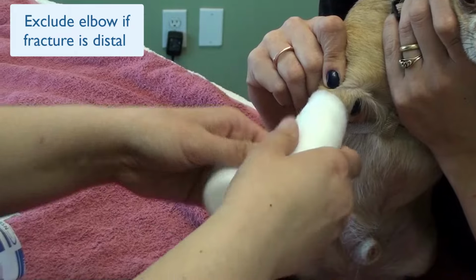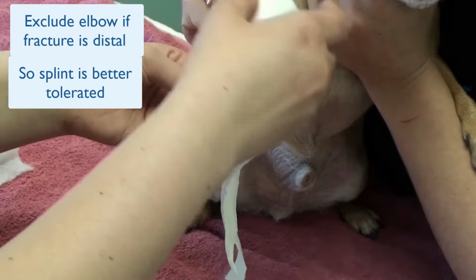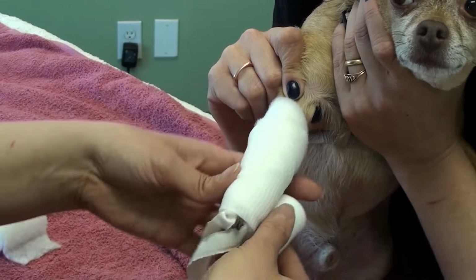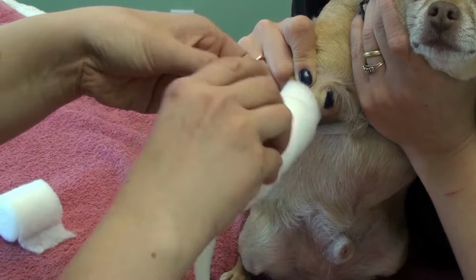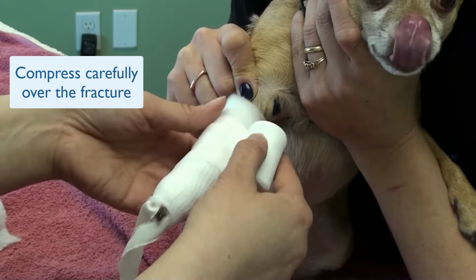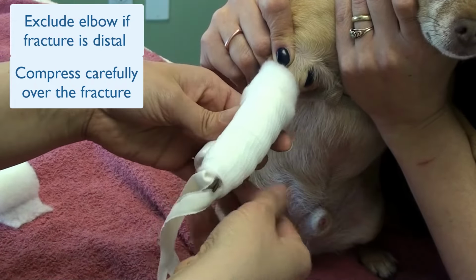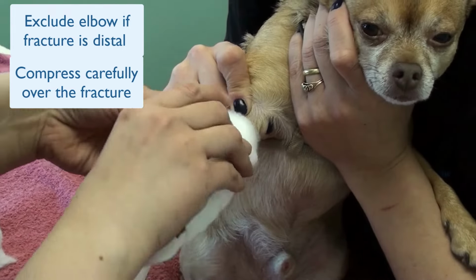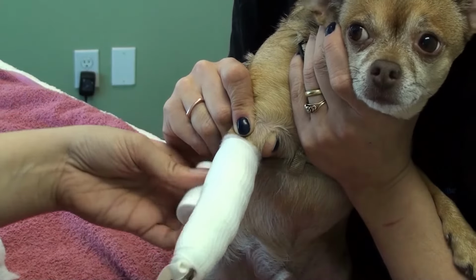So clearly she has started with the cast padding, and this is 2-inch cast padding, and she's used about half a roll. She's going to follow that with the compressive layer or the cling, and again she started over the fracture, but she doesn't start compressing until she is distal over the toes, and she's going to compress upwards. When there's a fracture, compression over the fracture can be quite painful, so maybe go slowly and compress less on that first turn and a little bit more on the second turn.